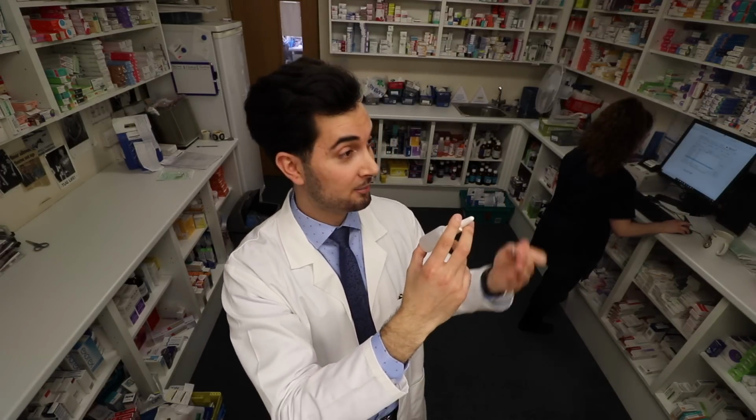So priming allows the chambers to fill properly so you get the right amount of medicine each time you use it. So to prime a nasal spray, all you do is point away from yourself, do a few sprays until it produces a fine mist, and now it's ready to use.